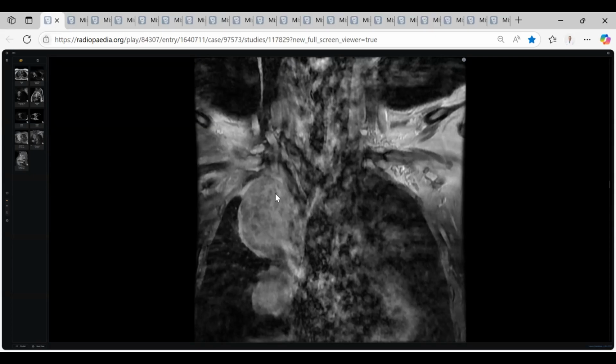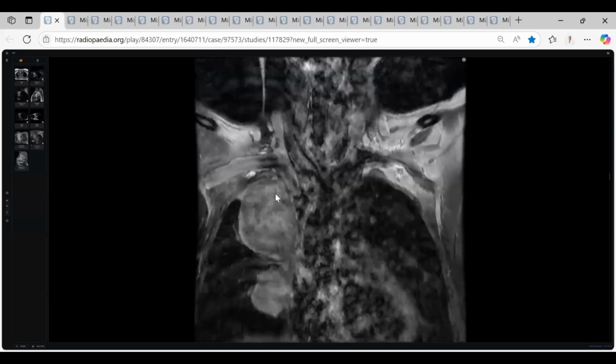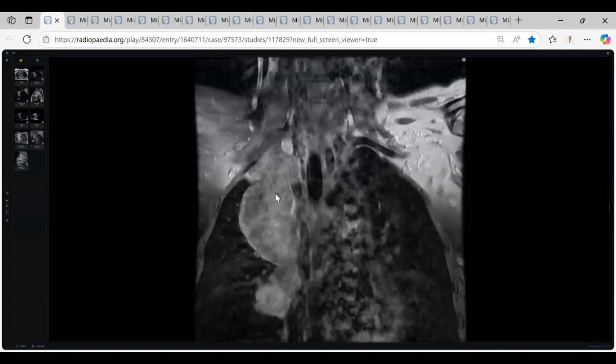Yes, this is a very good suggestion. But inside the exam we should tell the examiner all that is in our mind. I think this patient may have some sort of invasion, because of the very long contact and the indentation. The indentation in the thorax may be a sign of infiltration. Take care, my colleagues.